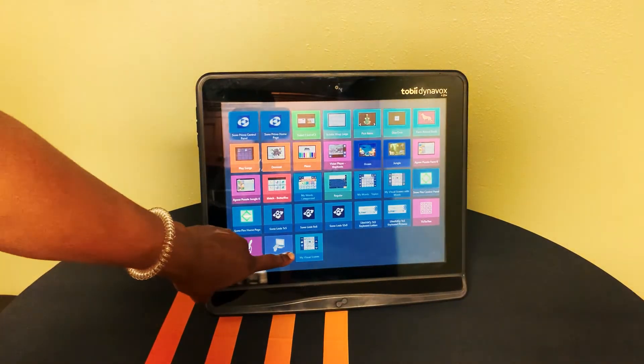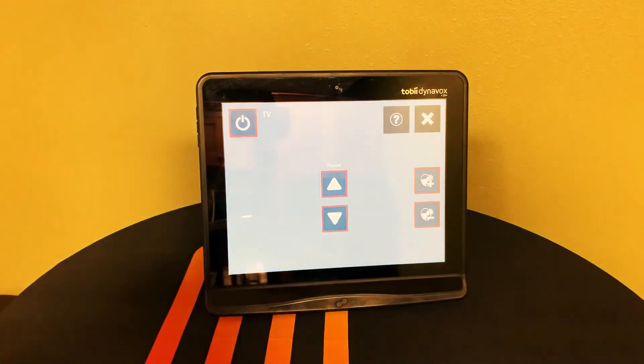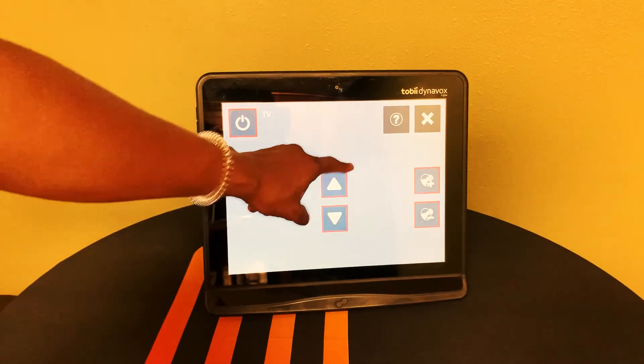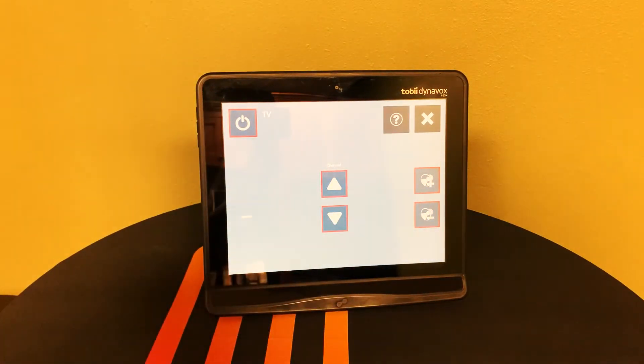Tobii can also be used to control infrared enabled devices such as televisions, heaters, air conditioners, and many more.